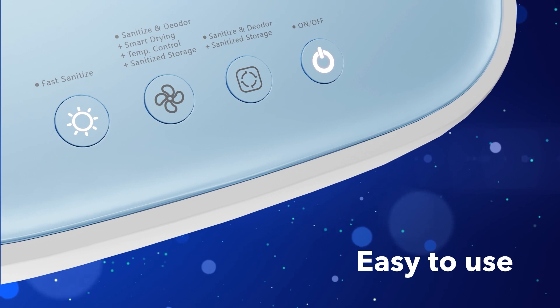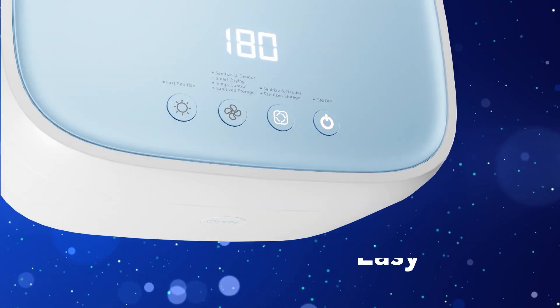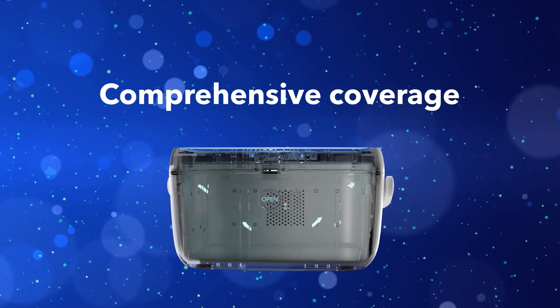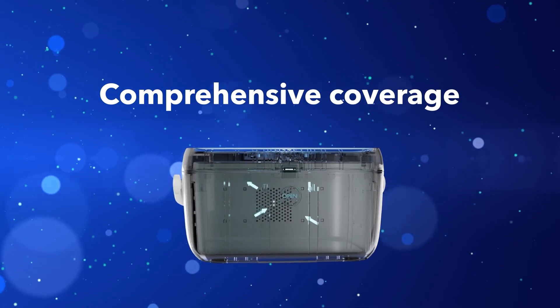Three different user-friendly operation modes take the hassle out of the process. Multi-directional, 360-degree sanitation ensures that every part of your item receives coverage, maximizing cleanliness and minimizing the risk of contamination.